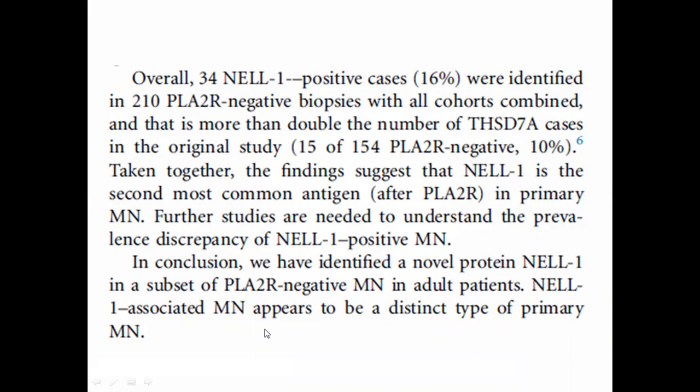What I want to ask is whether PLA2R was positive. Yes, he said that the patient had PLA2R positive on biopsy, but IgM was also positive in a case with IgG4, IgG3. So I must tell you that there are some cases of membranous which are associated with IgG4 disease. In those cases, there will be interstitial pathology, rising serum creatinine, and these patients will have an increased number of plasma cells in the interstitium, and along with that there will be membranous. But if you find PLA2R positive in this case, you don't label this as IgG4. You label this as PLA2R associated MGN. Yeah. Any more questions?